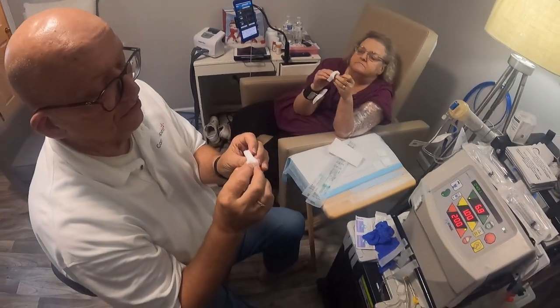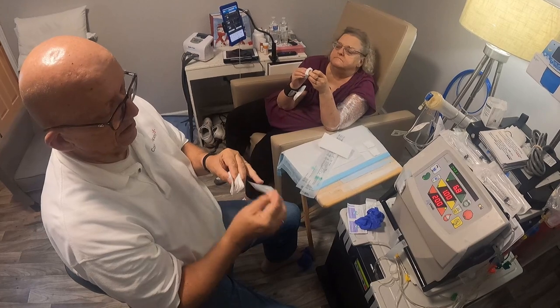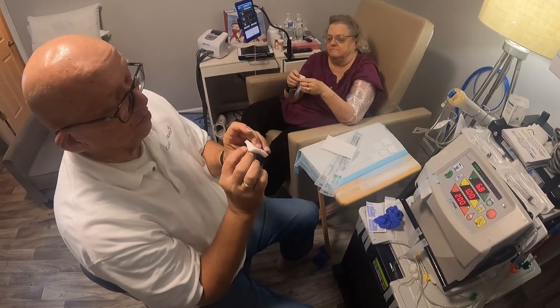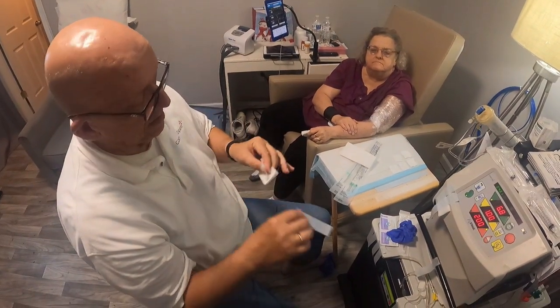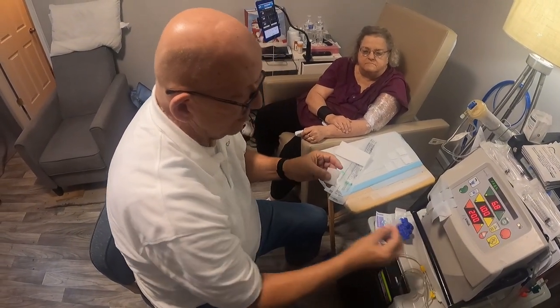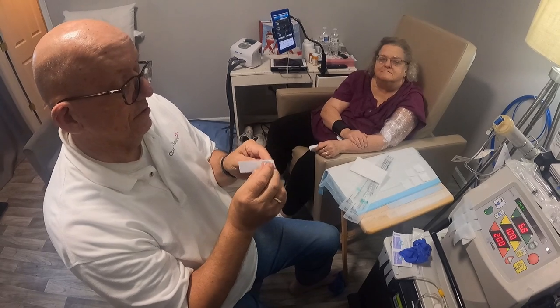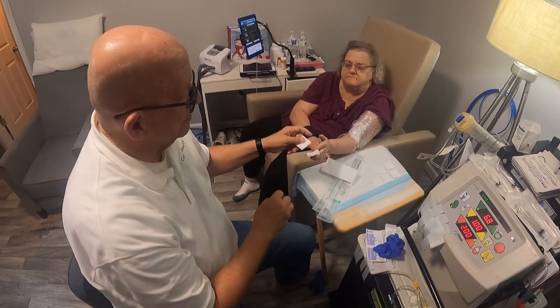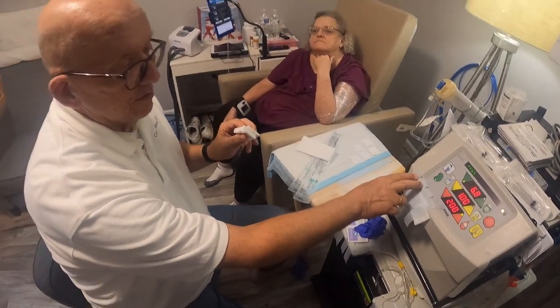We're going to do another one of these. Put that in the middle, put it right here. And we're going to take one and do that again. Then we're going to take one more. On the last one, you can cheat and do this. Put that right here. You'll see in a little while when we're sticking the needles in our arm. We'll use these two when we get started, and we'll use these two when we finish.